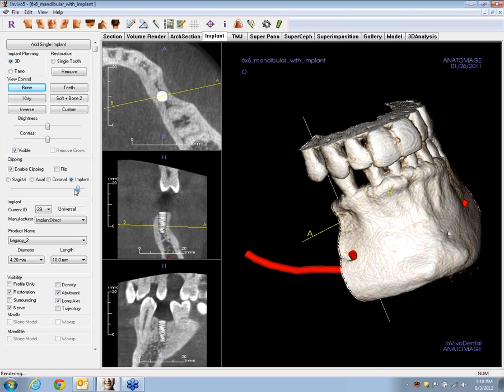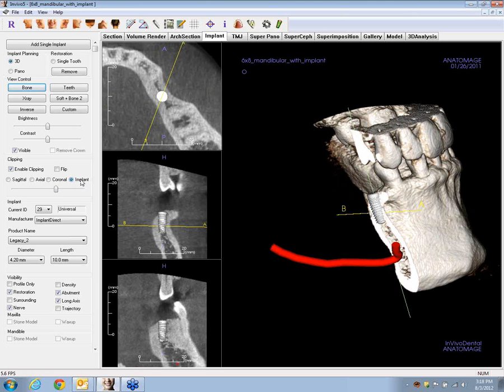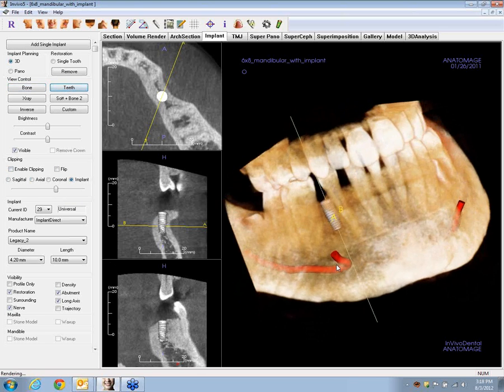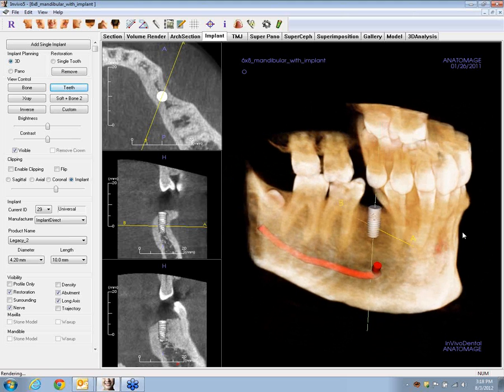The other obvious choice is to fill the undercut area with some filler, Bondo, and do some kind of bone graft there. But this looks like this one will take. Now, when we take a look at our implant in place here, we've got a reasonable angle to it. But ultimately, we're going to need to check that by putting a restoration in place. How do you do that?